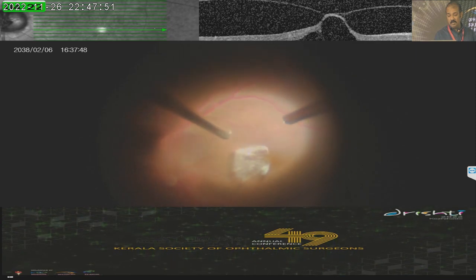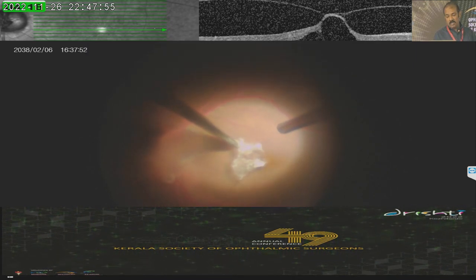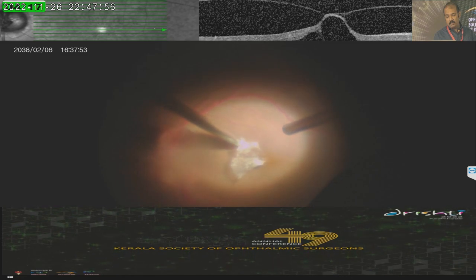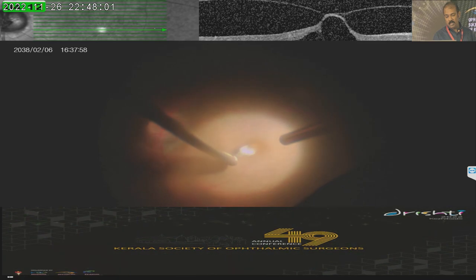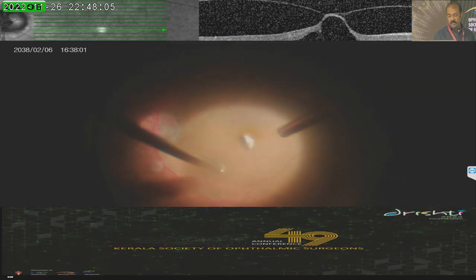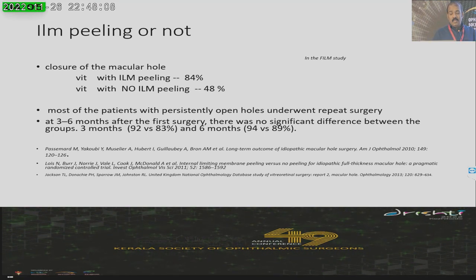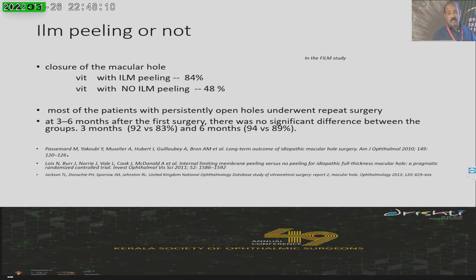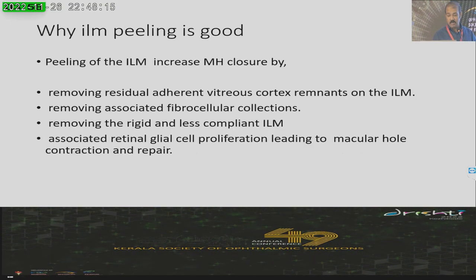With controlled reduced suction and a high cut rate, we can remove the posterior vitreous face, leaving strands of vitreous fibrils over the fovea. ILM peeling is definitely needed and shows better results — Dr. Manoj will be talking in detail on that. Most patients who need vitrectomy for VMT will be age 60 or above and will have or develop cataract at the time of diagnosis.